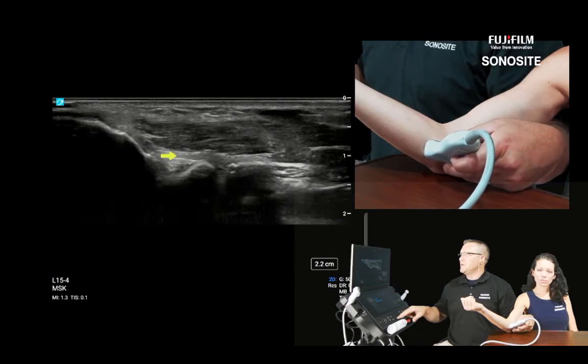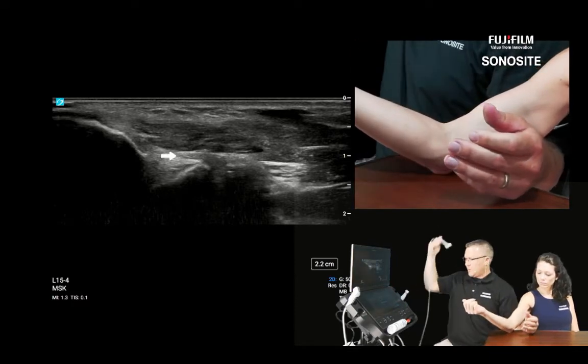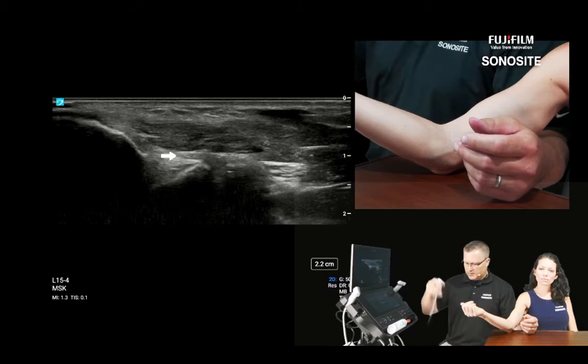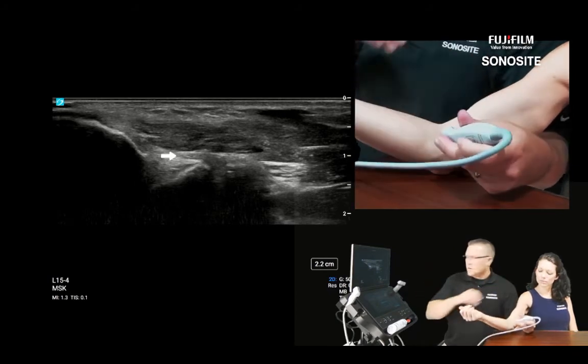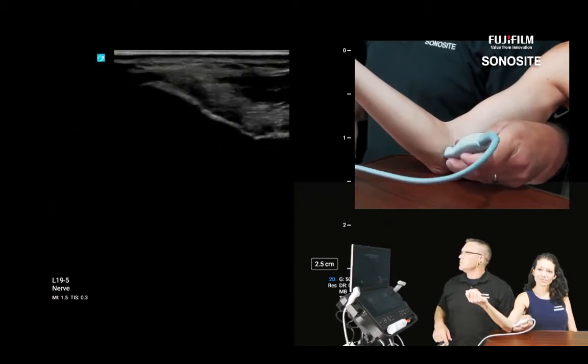And we'll switch over for comparison to the L19 just to look at those differences in how we can see the enthesis much nicer. Little NASCAR pit stop here, changing over.